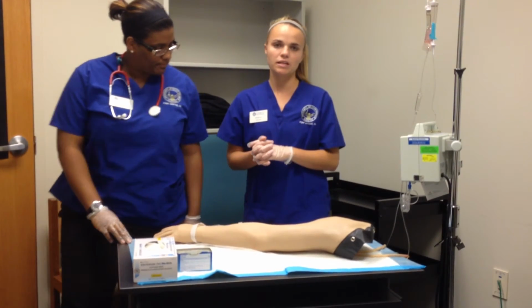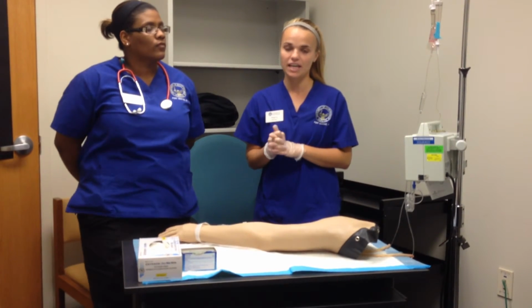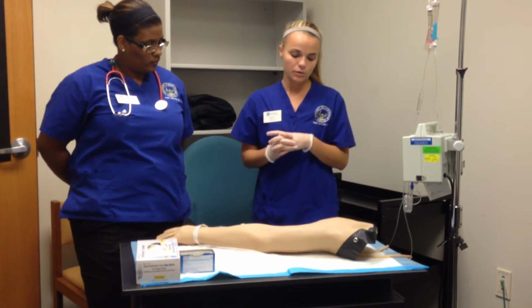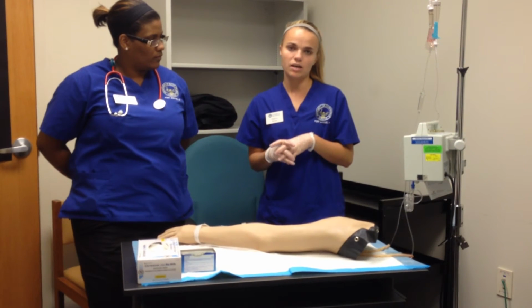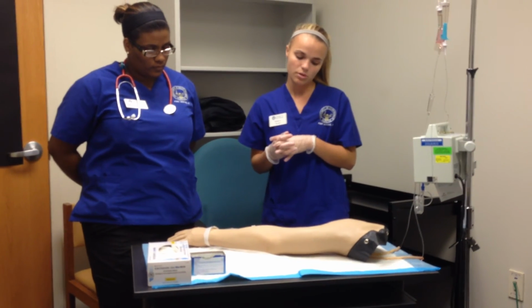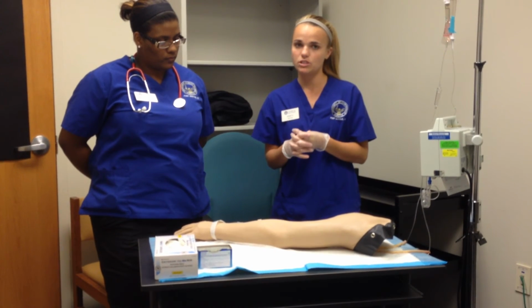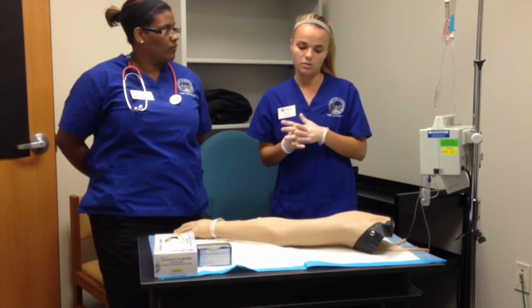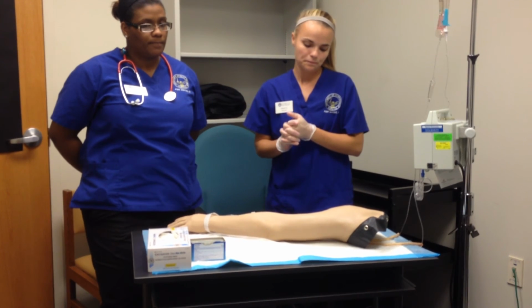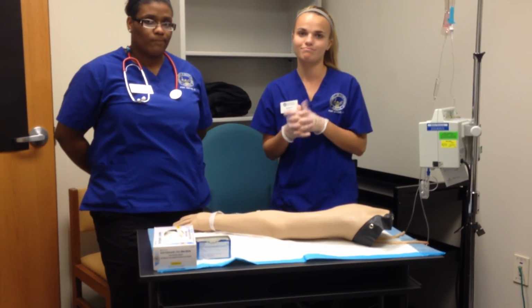So with transfusions, your main thing is that you want to make sure that the blood matches your patient by doing identification checks with more than one nurse by your facility's protocol, whether it's 2 or 3. You want to make sure that your blood is of the typing that your patient needs and that it's not contaminated. You also want to stay with the patient for the first 15 minutes of the initial transfusion to make sure there aren't any adverse effects, and check on them every 15 minutes through that 2 to 4 hour window. And document any findings or abnormalities right away and contact your physician.